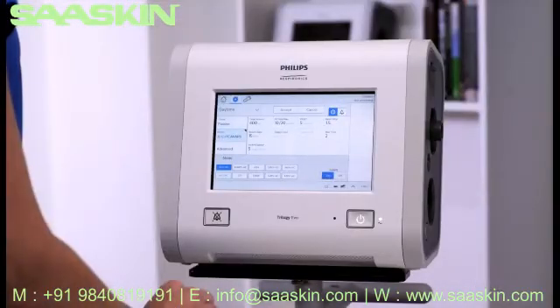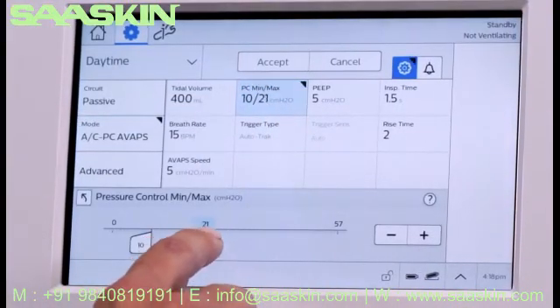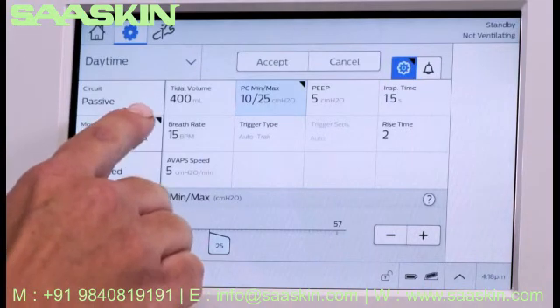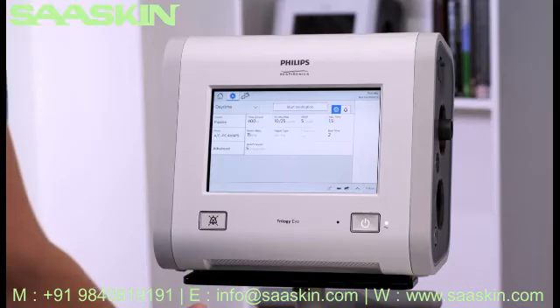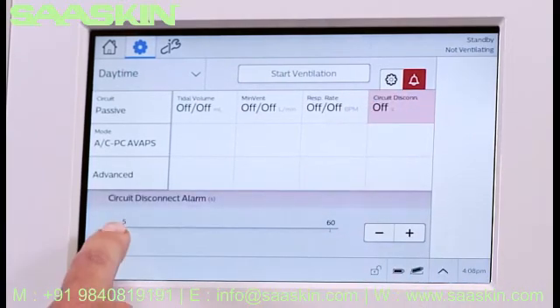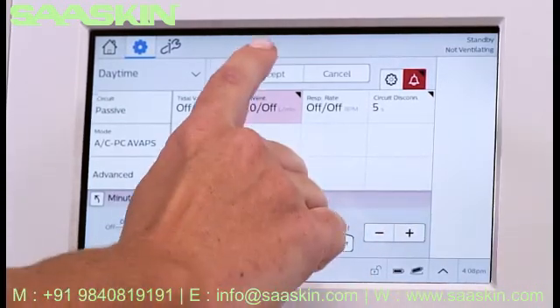Now we'll edit some of the prescription settings. Tap Pressure Control Min Max and use either the slider bar or plus and minus controls to adjust the setting. Once a parameter has been edited, a change indicator will appear in any altered setting box. To save the changes, tap Accept. To set the alarms, tap the Alarm icon to view and edit applicable alarms. In this example, we're setting the circuit disconnect and low-minute ventilation alarm. As with the prescription settings, tap Accept for the alarm changes to save.